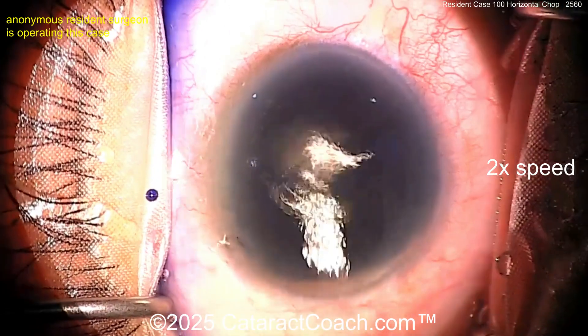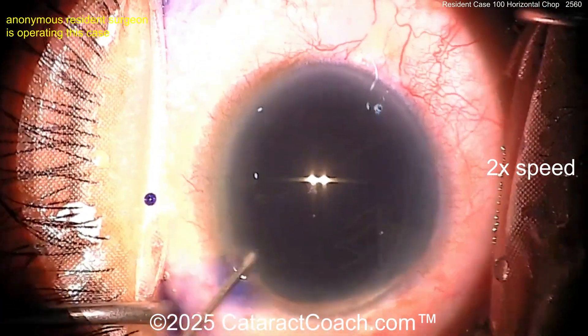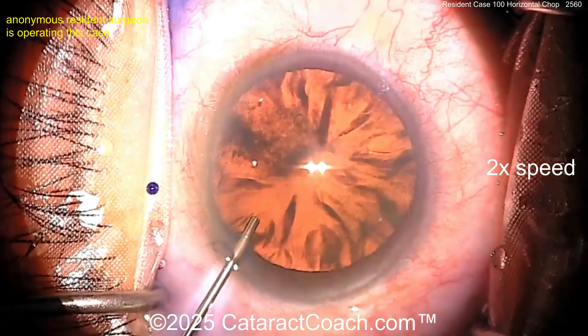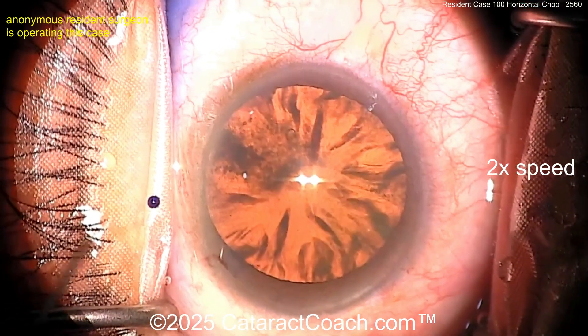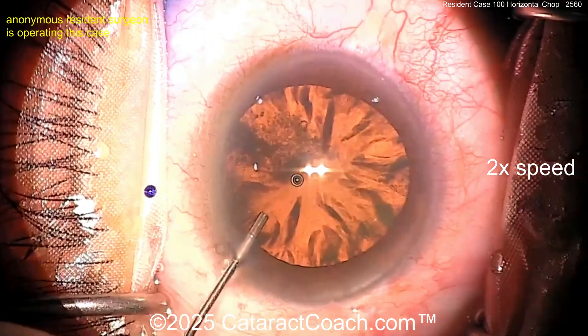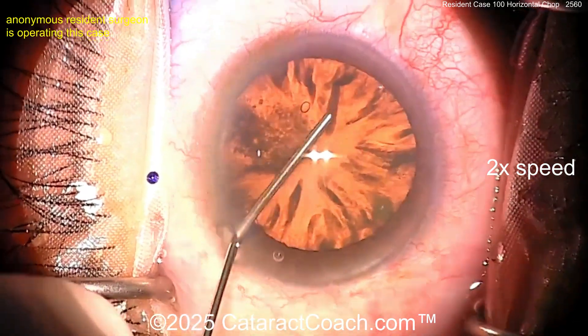You see the two reflexes on the center of the cornea — those are the coaxial lighting within the oculars, lined up with the oculars. There should be a paraxial light too, and that way you'll get overall lighting of the field as well. A little bit of trypan blue went inside the eye.